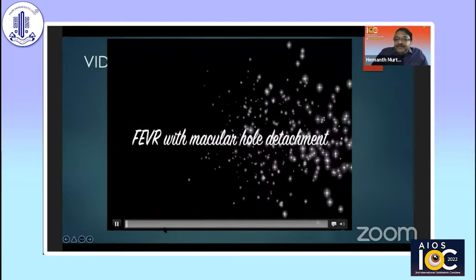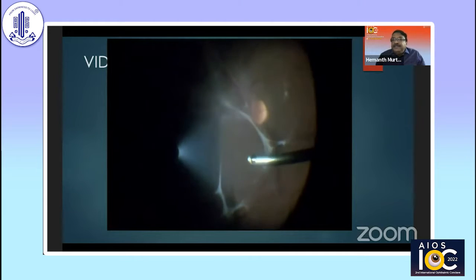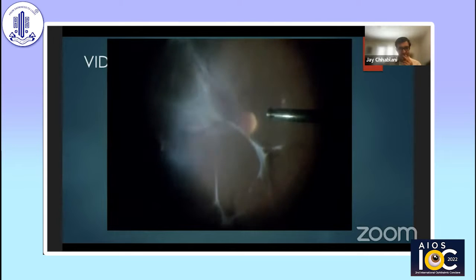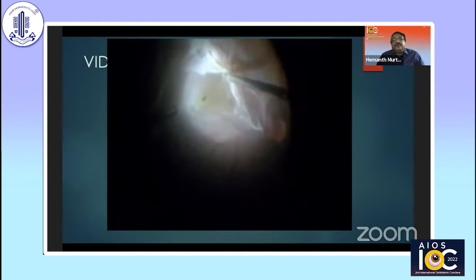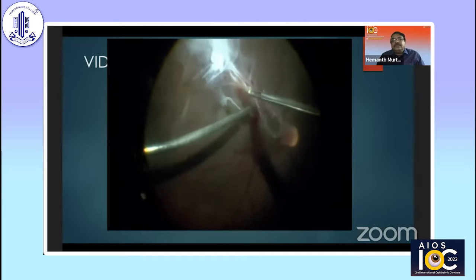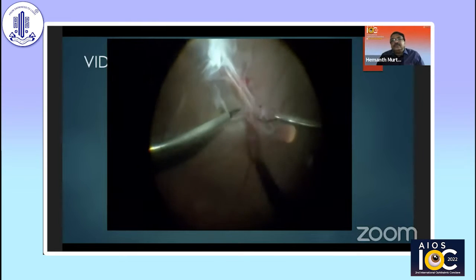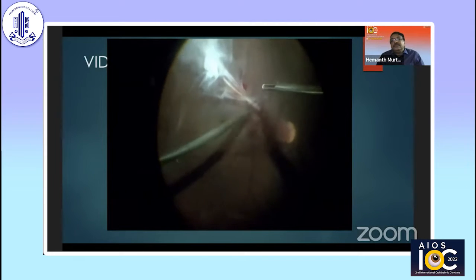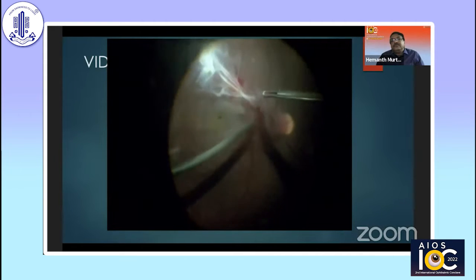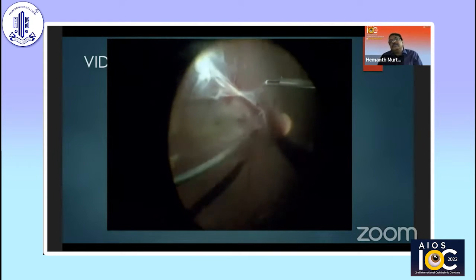This is a video of a patient with FEVR with a rare complication of macular hole detachment. The OCT shows the macular hole detachment. I started with the cutter, but then I found that it is difficult to separate the membrane from the retina, and I changed over to bimanual dissection. The bimanual dissection is an excellent and elegant way to separate the membrane from the retina. Here you can see that I'm using the scissors with its blades closed to do a blunt dissection and separate the membrane from the retina without damaging the blood vessels and the retina.